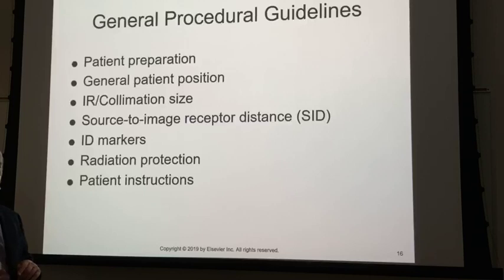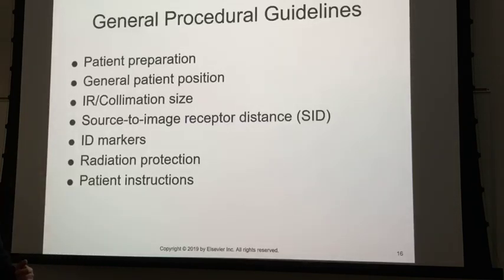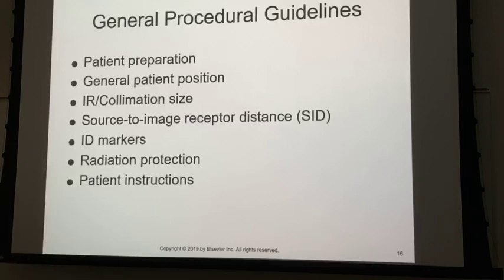So know what you can take off, know what you shouldn't take off. Splinting material, casting material, certainly not, but things like bracelets and rings, if they will come off, really need to come off with the patient.